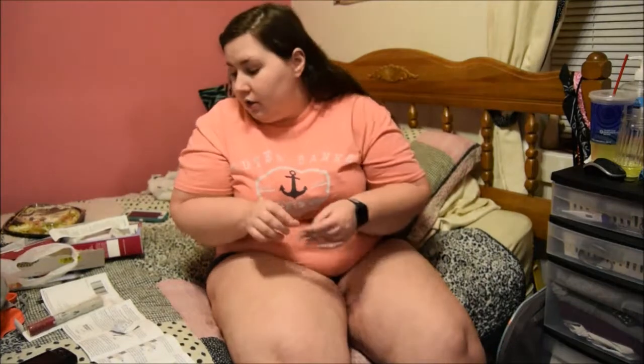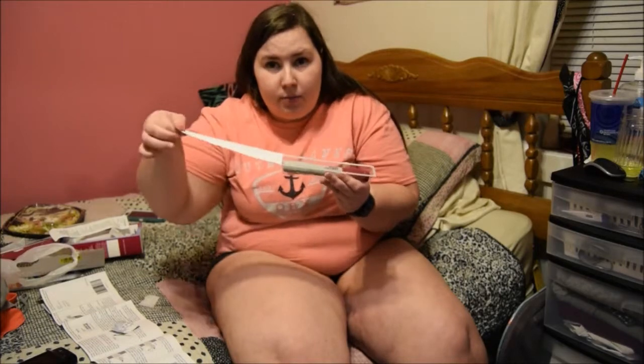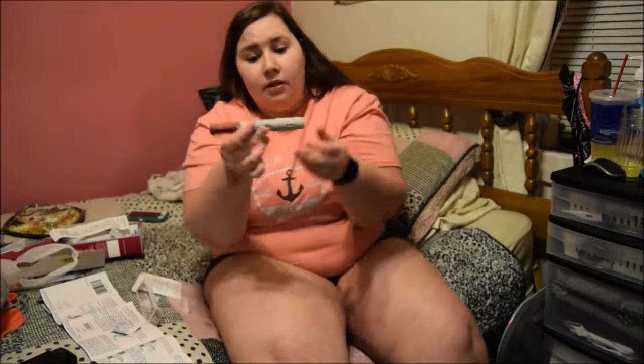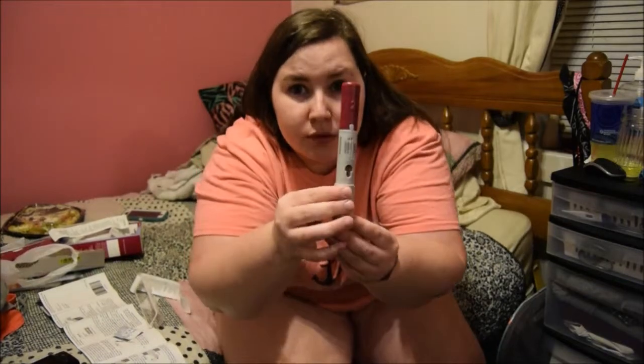So this one you'll get a good view of it. You take the pin out very lightly. It just peels back like that. Take it out. Make sure you don't drop it. Make sure it's filled to the line, which you guys will see on your pins.